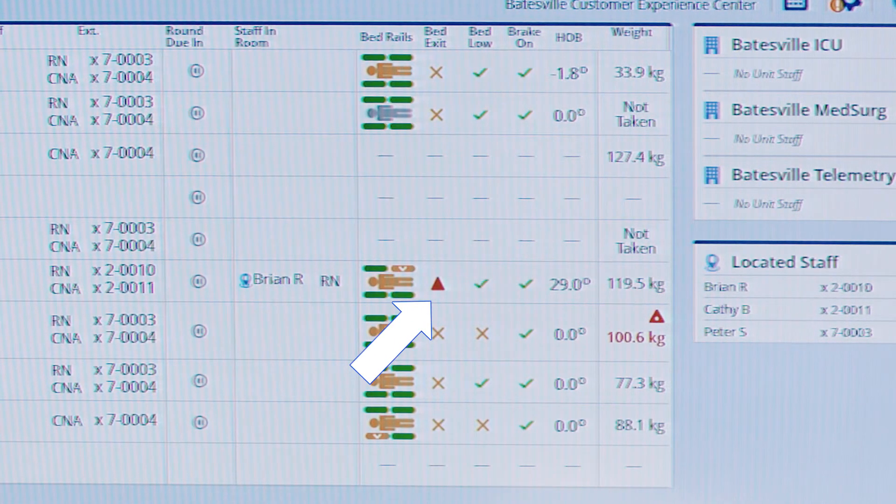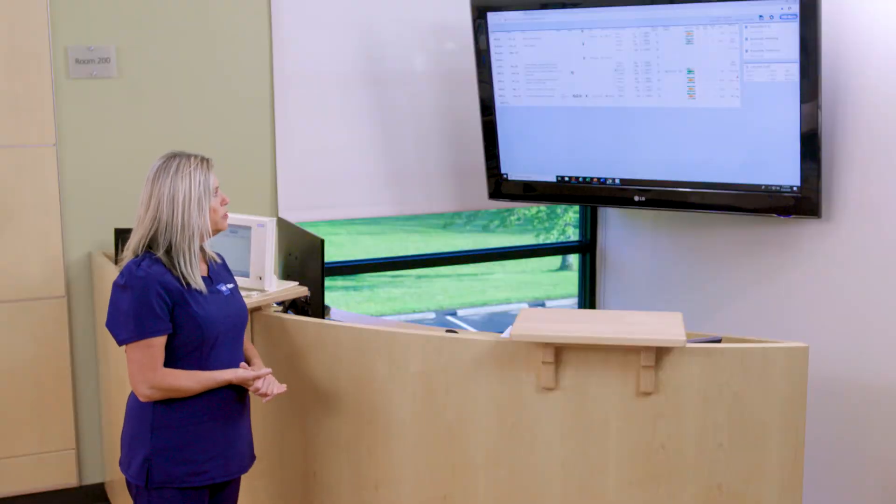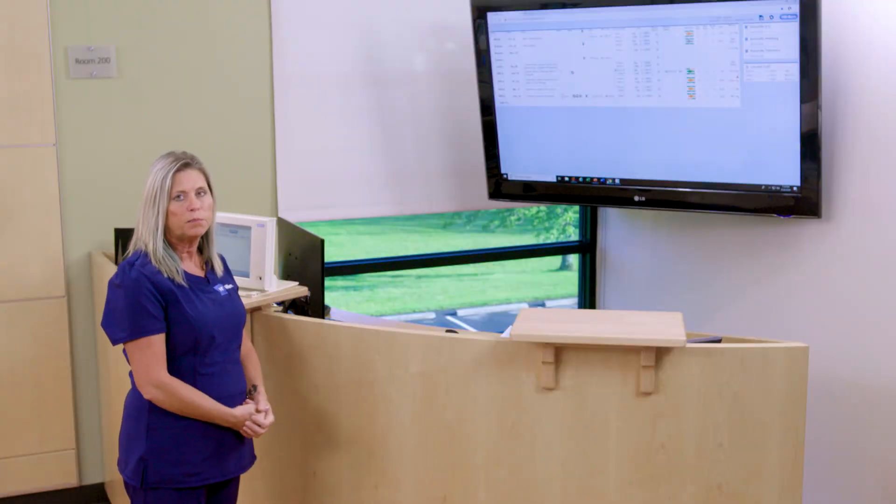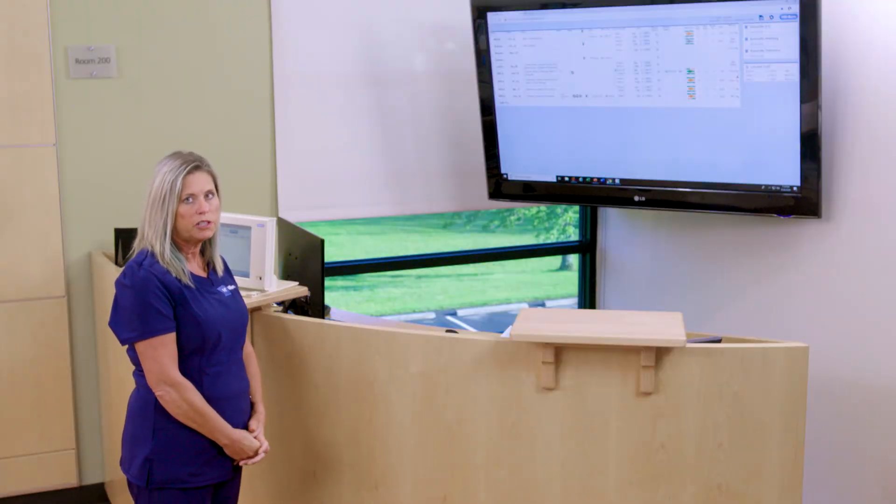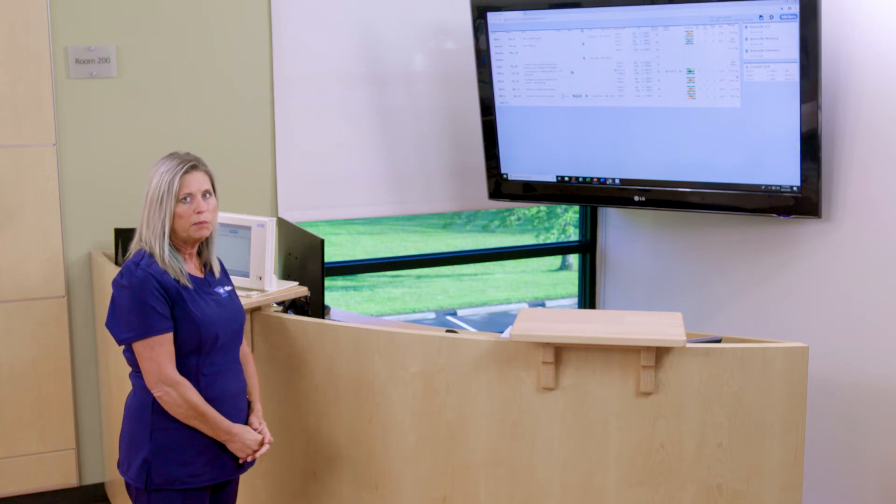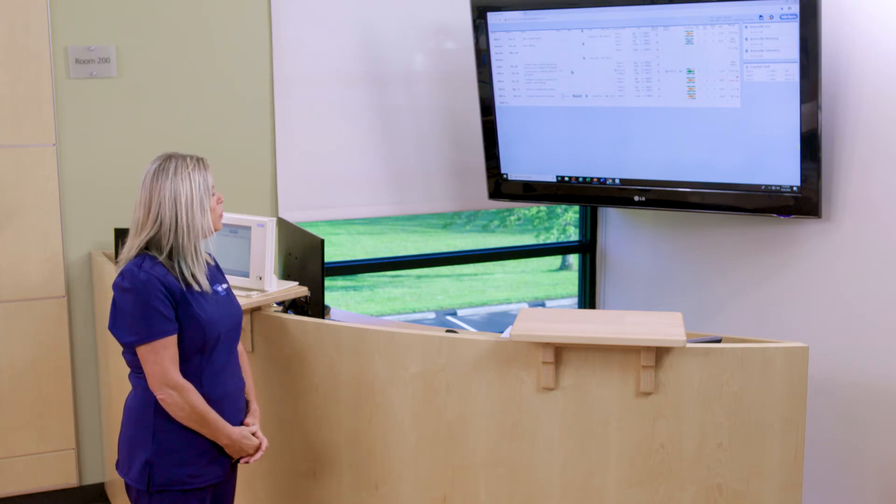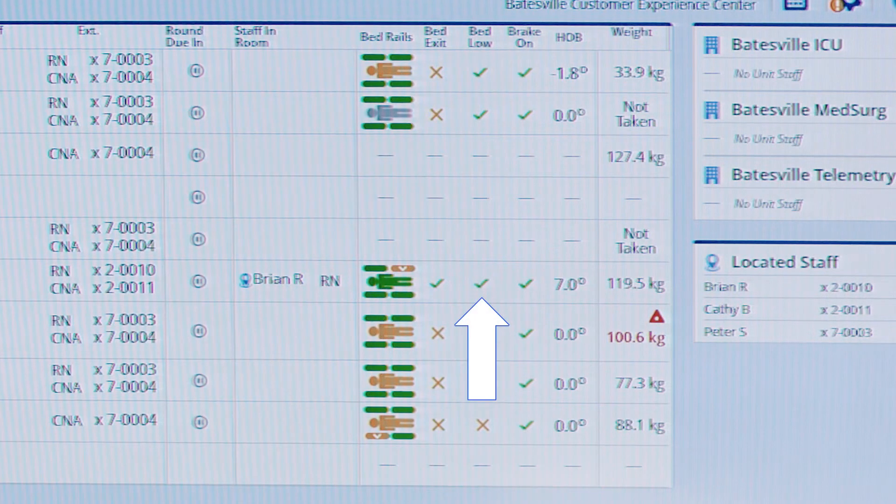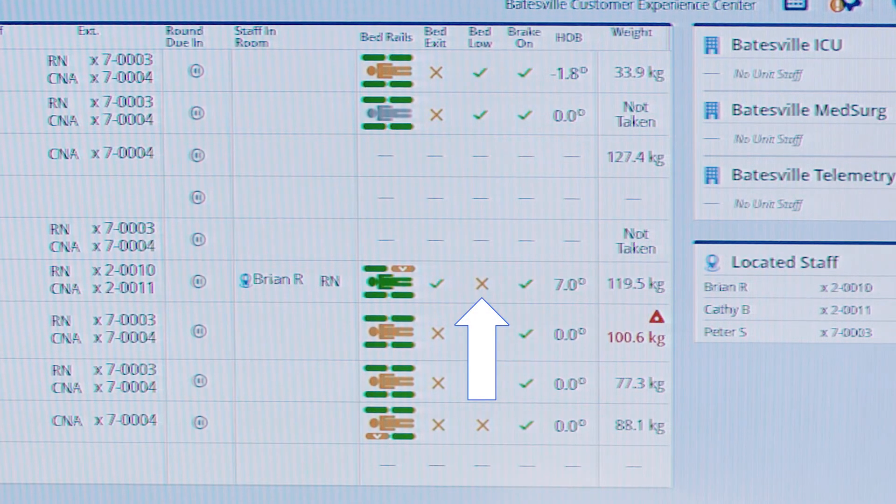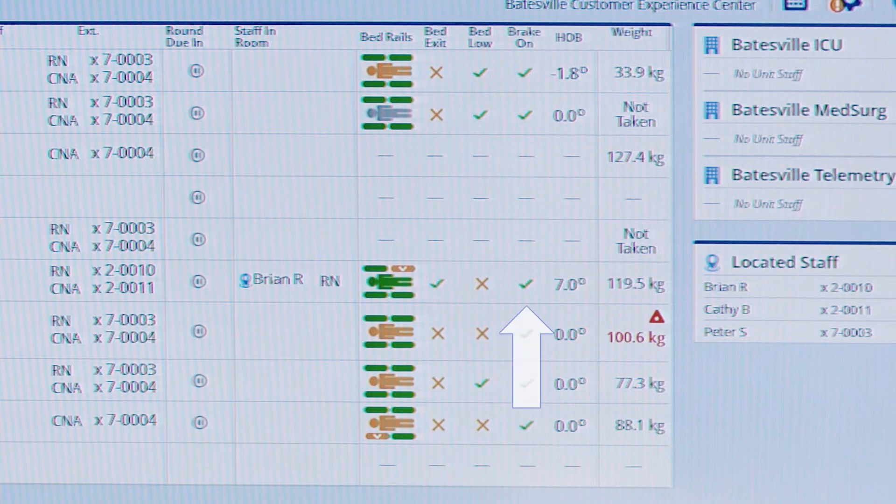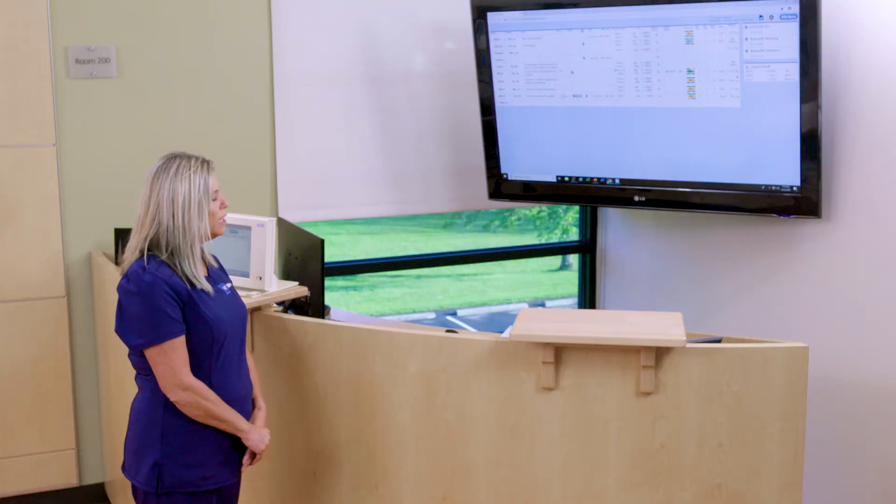We can also see currently that the bed is positioned in the low position. If the patient or family member adjusts the bed, we will see an immediate change that the bed is no longer in a low position. We can also see an indicator with a check mark that the brake is set on the bed.